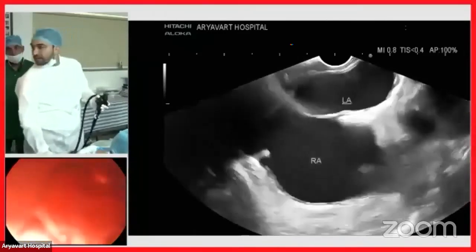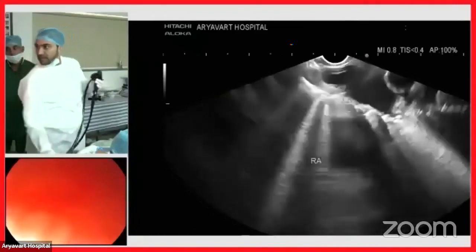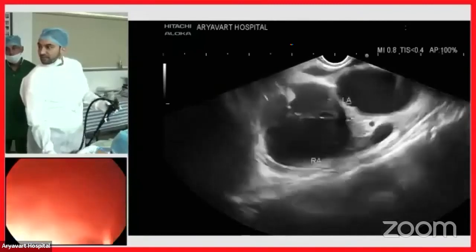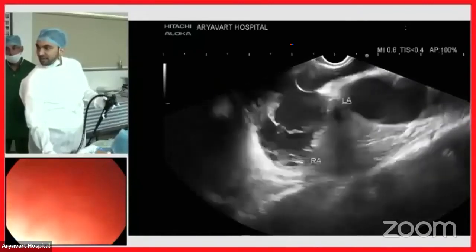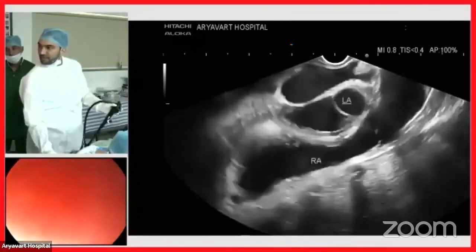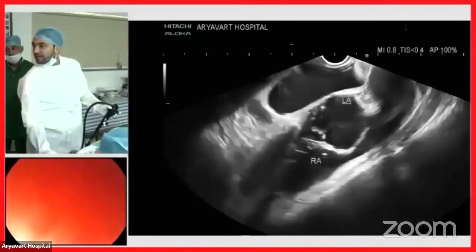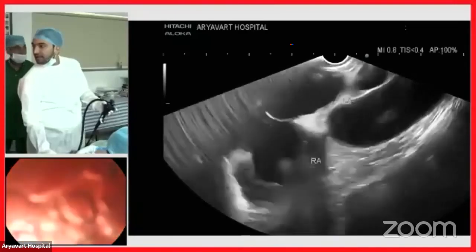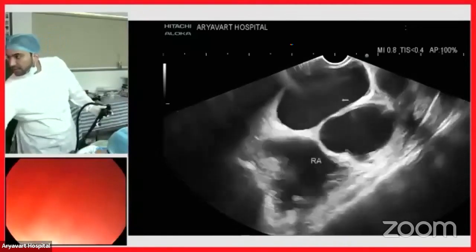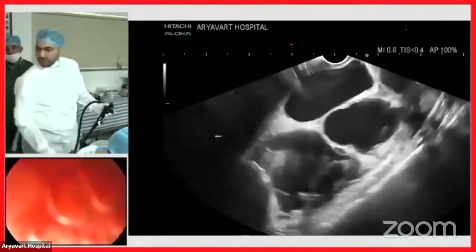Dr. Vikram Bhatia yesterday very beautifully showed all the cardiac chambers. I'll just show them once again. So this is the right atrium. We can see a glimpse of the right ventricle over here, left atrium. This is the left ventricular outflow tract and the aortic valve over here. And here it becomes the aorta. So how do we clear the, okay, the whole thing is cleared.